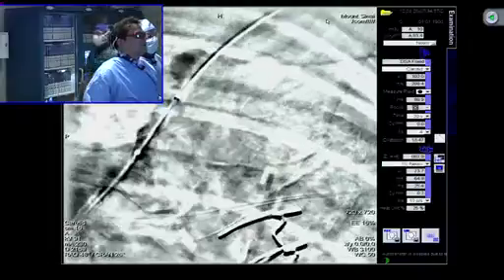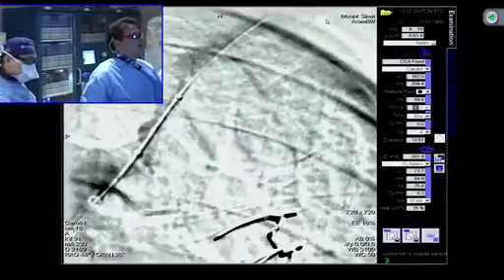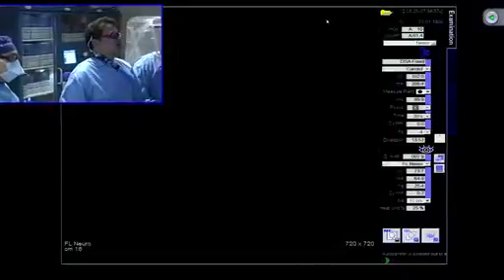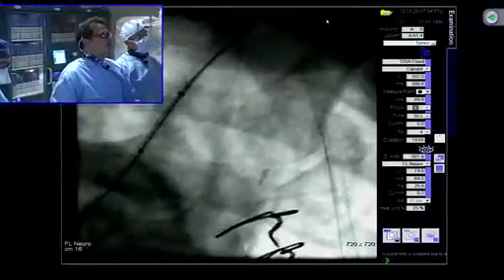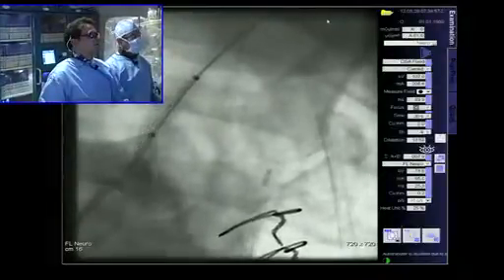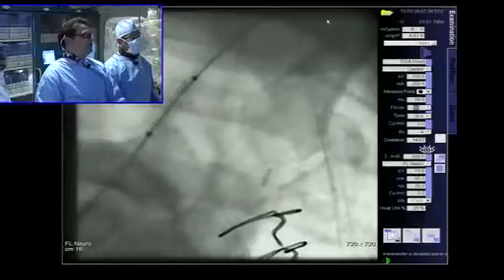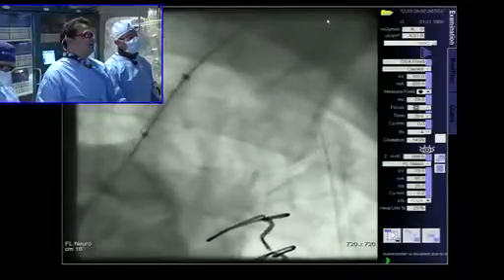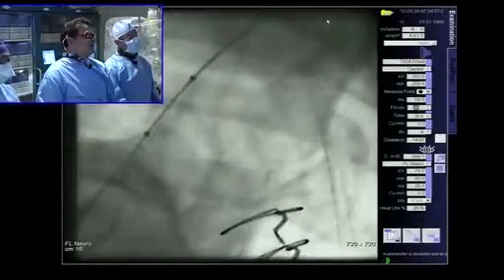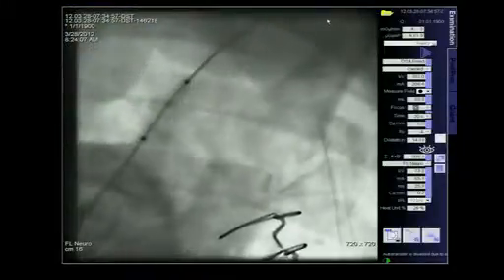Right. So I am going to advance this a little bit forward because I do need to go ahead and balloon this. So I'm going to go forward a little bit now. And you can see here, a little test ray. I'm happy right there, George. I'm going to go up with this. We may be slightly across the vert, but I think that should be okay. And here's a 4 millimeter balloon going up.